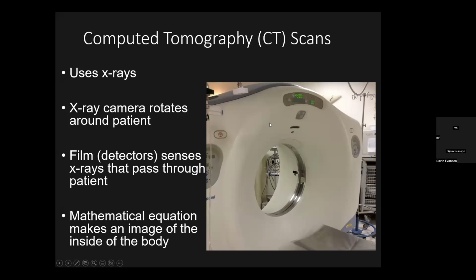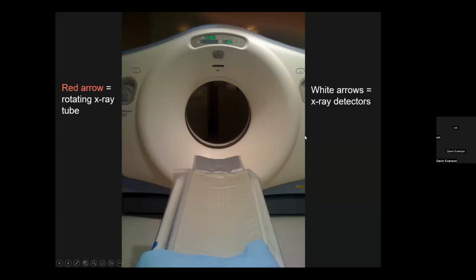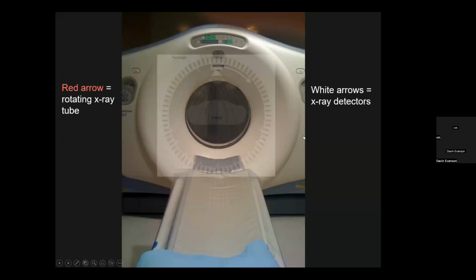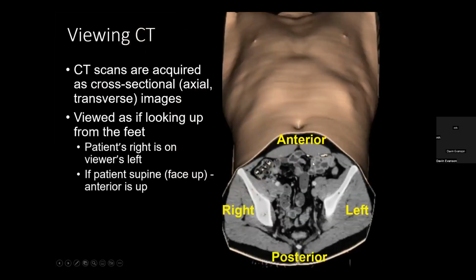So what is a CT scanner? Well, it's basically X-ray detectors going around 360 degrees as the patient goes through the tube. And there's some fancy physics here, which you can read more about on your own. But we have the X-ray detectors in white all the way around, and the X-ray beam going around being detected by these different detectors to put all the information together, and basically using some pretty advanced calculus to figure out what the density at each point or voxel is in the human body. And you can get some very detailed information, stuff we could not get with just regular radiographs.